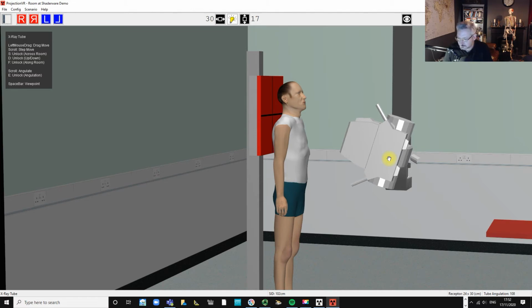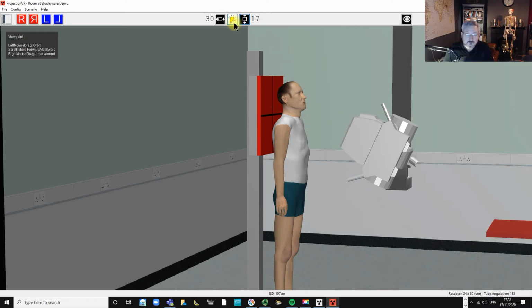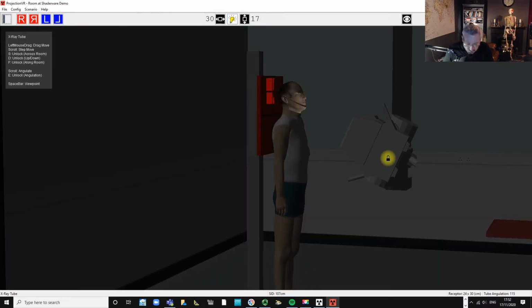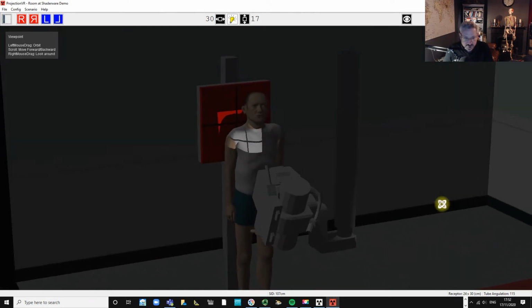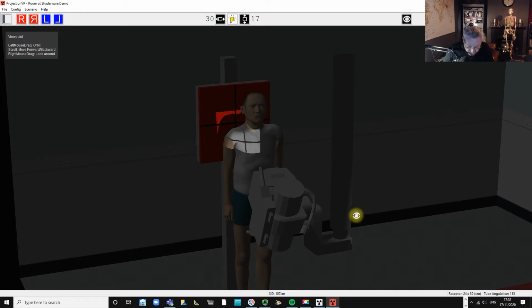We'll try 25 degrees, so that's 115 degrees. So I'll drop that down. I've shone it in his eyes again, which is never a good thing. And bring the tube in.